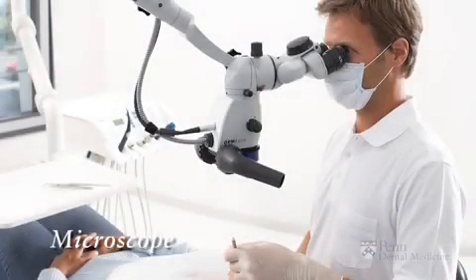The use of microscope in dentistry has been one of the latest trends to perfect acute vision for the dentist. Microscopes offer the dentists the ability to see microcracks, weakened underlying tooth structure, and proximity of dental nerves with precision. The microscope is an improved diagnostic tool as well as a treatment-assisted tool. Today, this technique is used to improve the precision of surgery and root canal therapy.